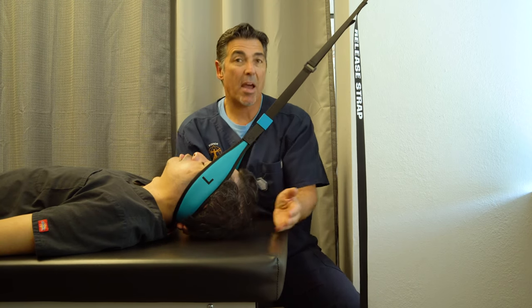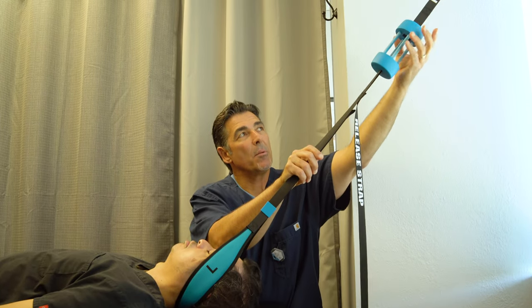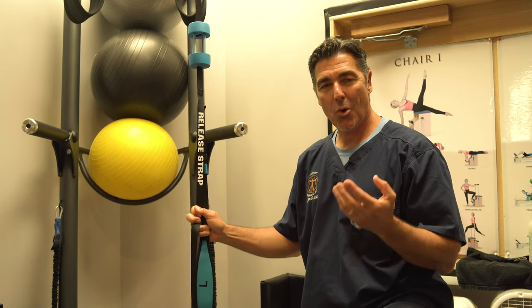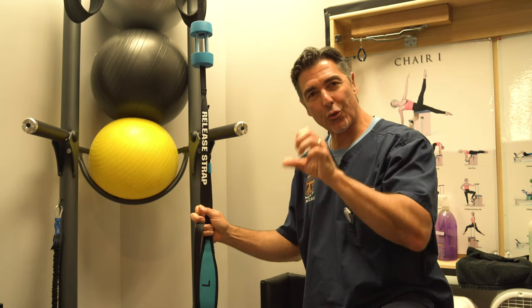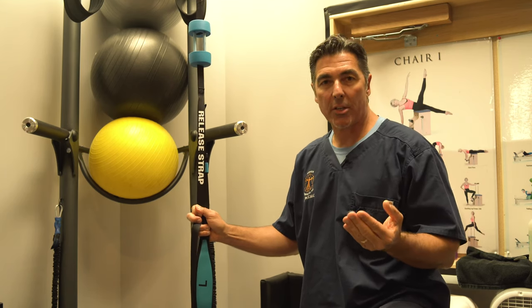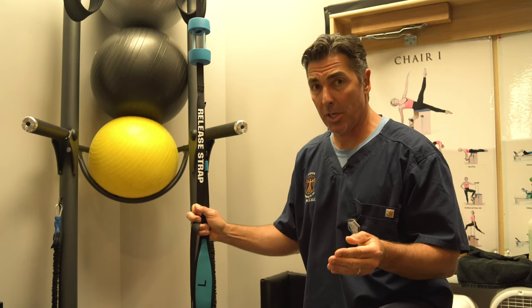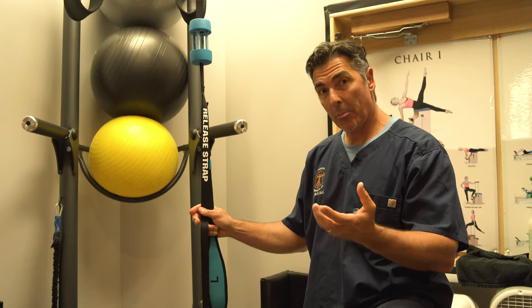Fisher Traction has nowhere near those limitations, with our patented negative G-force technology capable of pulling up to a maximum of 50 pounds of pull force. The desired long-term outcome of traction is spinal decompression — you have to create negative pressure inside the disc where it sucks or retracts any bulging or herniating disc away from nerves. In my opinion, you need minimally 20 to 25 pounds of pull in the cervical spine to get any real therapeutic value of traction and to accomplish decompression.